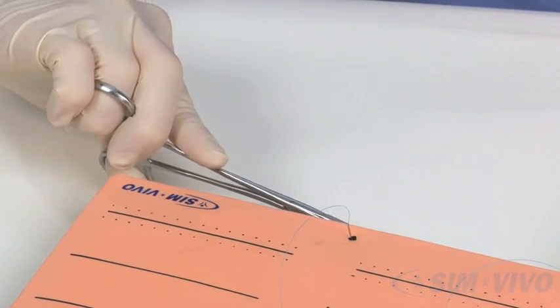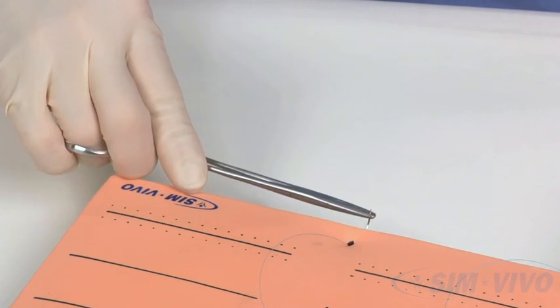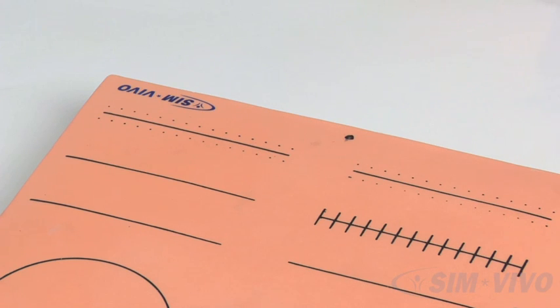Now pronate your hand once again and grasp the end of the needle perpendicularly with the end of your needle holder. Supinate your wrist and hand to follow the curve of the needle until it completely comes out of the foam. Pull the suture completely so that you can start over. Now let's practice that one more time.